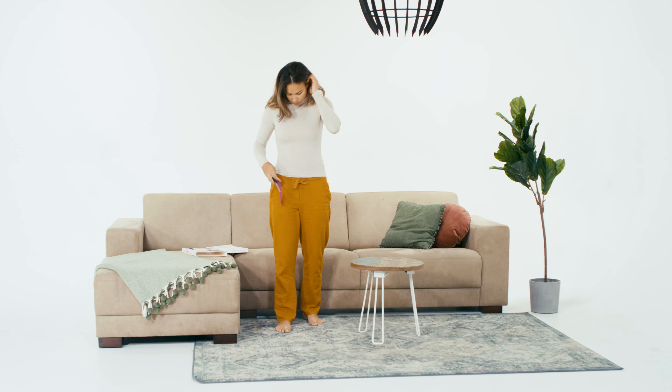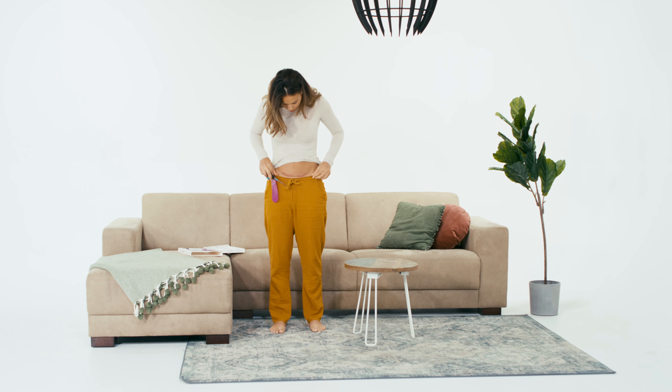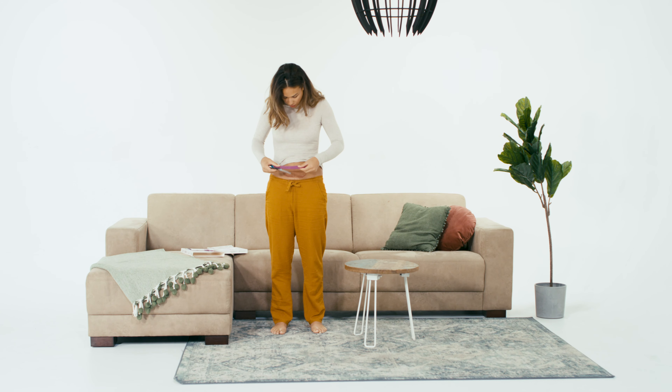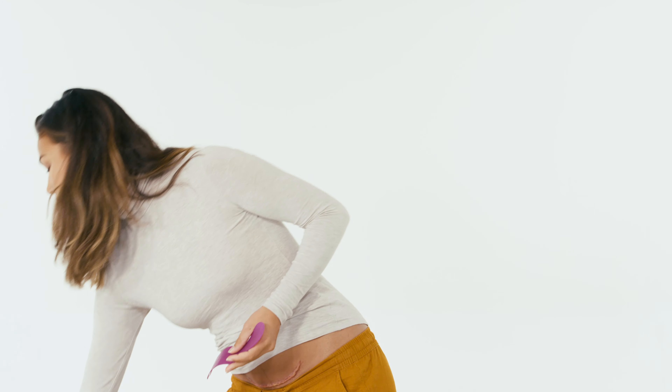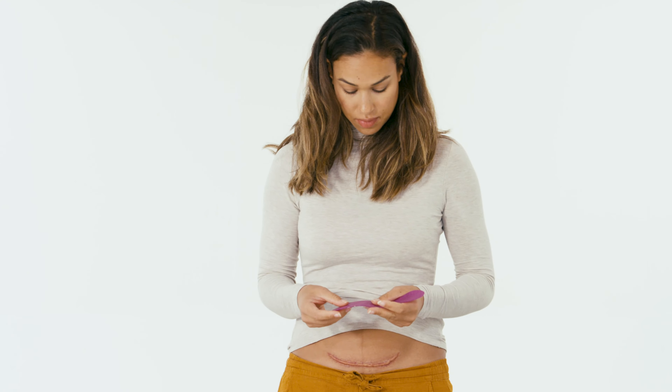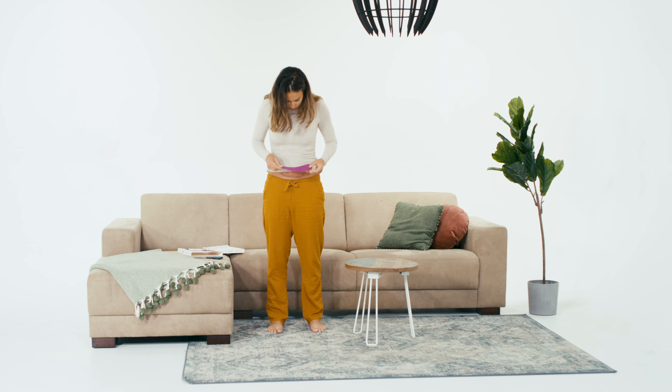Apply Scar Band for at least 12 and up to 23 hours a day. The longer your daily treatments with Scar Band, the faster you can expect results. For good adhesion and durability, it is advisable to remove any hair around the scar and thoroughly clean and dry the skin on and around the scar.